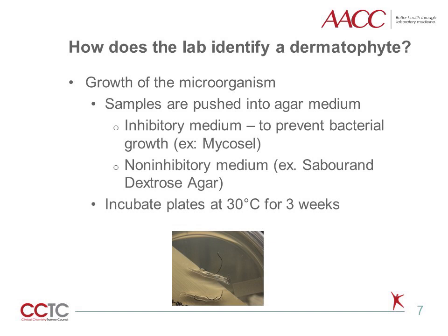Analysis of the protein structures through matrix-assisted laser desorption ionization time of flight, or MALDI-TOF, is a relatively new method that can be useful in obtaining identification to the genus and species level. Sanger sequencing of the internal transcribed spacer, or ITS region, can also be employed. Keep in mind that identification can take several weeks as well, especially in labs that send out their isolates for identification. That means a positive mold culture can easily take over 5 weeks for an identification.